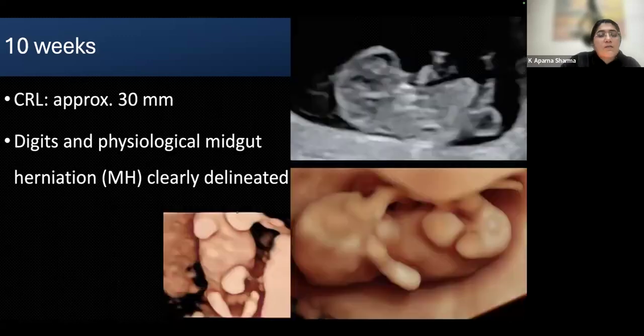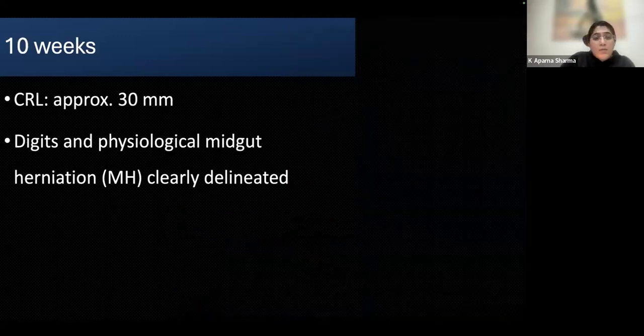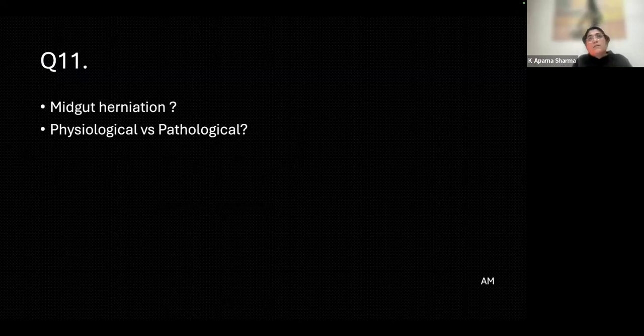Right. So I think this is a great approach that you're talking about. I think this is something very special, Dr. Prasanna, like pushing the boundaries now, and really trying to correlate and going beyond what is normally done. And honestly speaking, I have recently started doing this sonoembryology, but I do think it requires a lot of time and effort. So that's something to be kept in mind. If we are in the habit of doing a proper 3D, it will hardly take seconds, ma'am. Even a proper multiplanar imaging will be done in a few seconds.